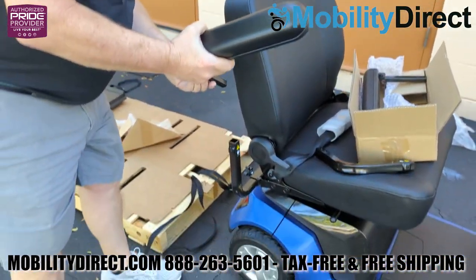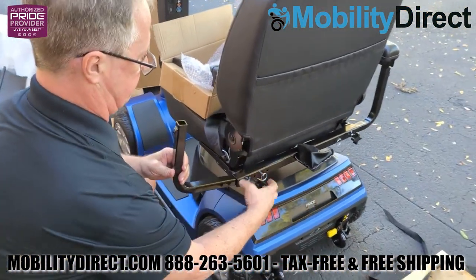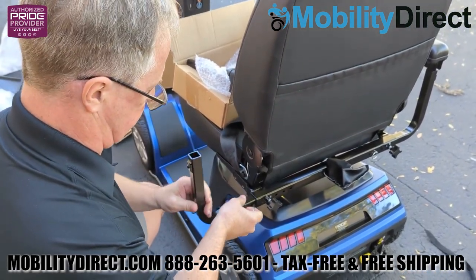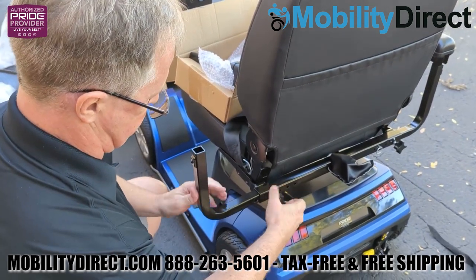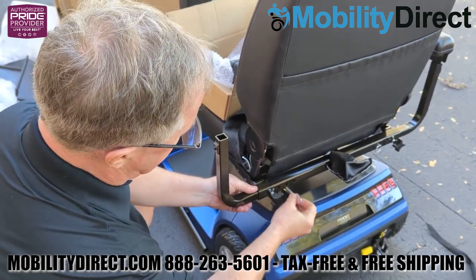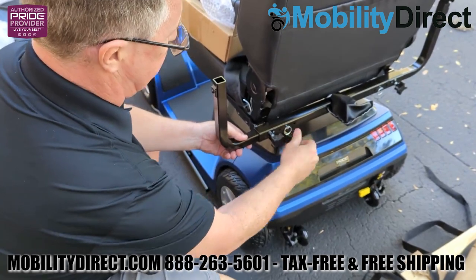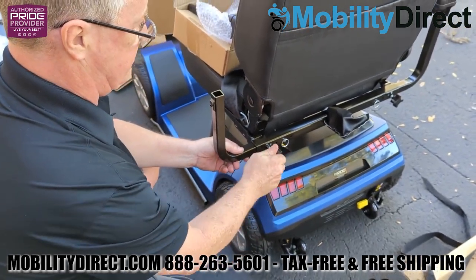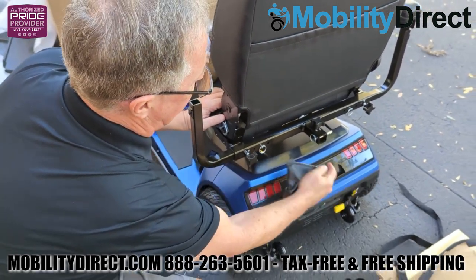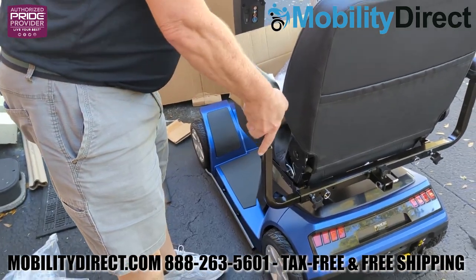You'll want to repeat the same process on the other side. Once you have both of the elbows in, the armrests just fall right into that 90-degree elbow sleeve. You can adjust the width by using those tension adjustment knobs and the securement pins. There are three different holes on the armrest rail, so you can slide the armrest 90-degree angle out or in to bring them either closer together or further apart, depending on the user's preference. There's also a one-inch universal hitch receiver on the back of the chair to use for rear baskets, oxygen tank holders, and many other accessories.